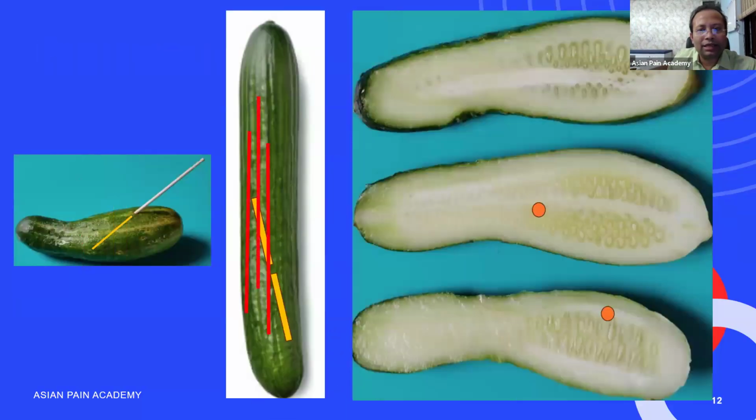So here also, as I told you, in this section you will see that when I have made the section, the second one is cutting this yellow stick. But the first one, the leftmost line, is not even cutting it, and the third one is also cutting.